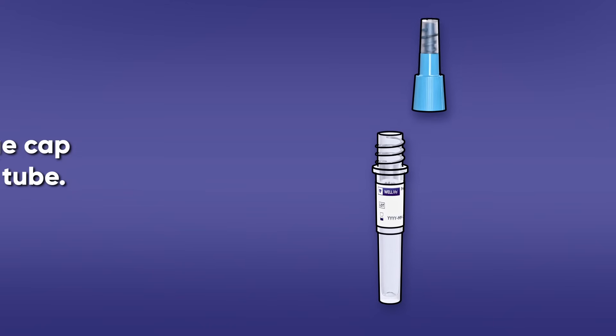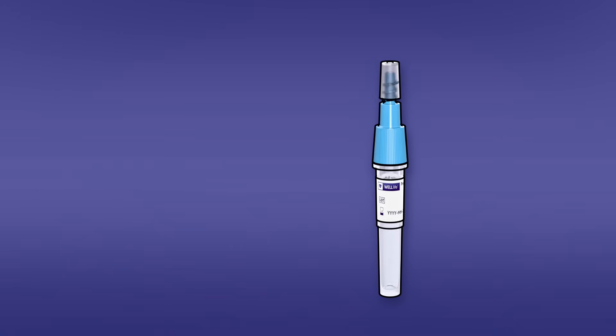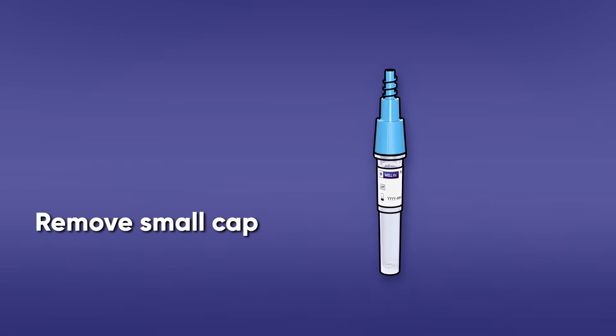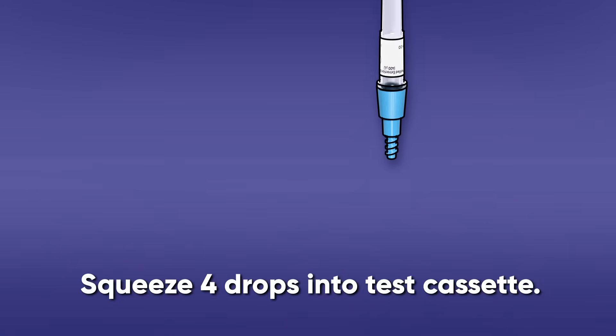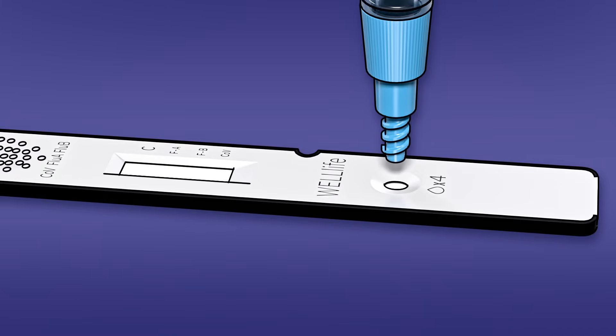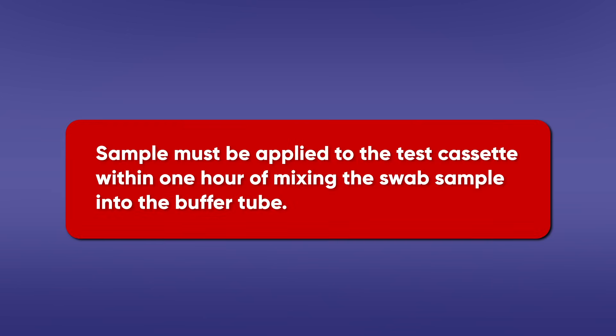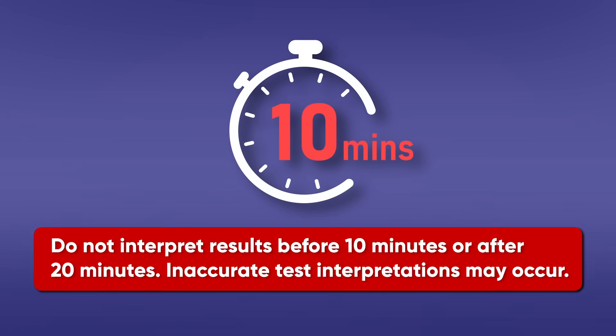Remove and discard the swab. Hold the buffer tube upright and screw the large cap back onto the tube — ensure a tight fit to prevent leaking. Twist to open the small cap at the top of the tube. Invert the buffer tube and squeeze four drops of test sample into the sample well on the test cassette, then discard the buffer tube. Note: incorrect results may occur if less than four drops are added. The sample must be applied to the test cassette within one hour of mixing. Start a timer and read results at 10 minutes. Do not interpret results before 10 minutes or after 20 minutes, as inaccurate interpretations may occur.